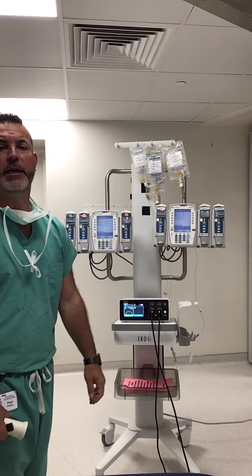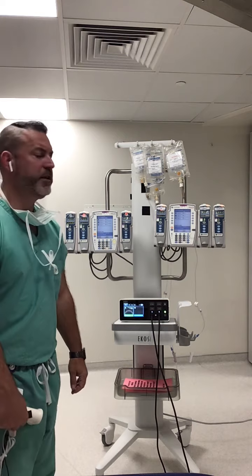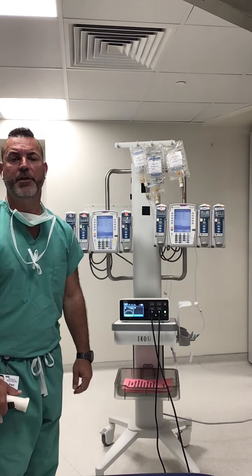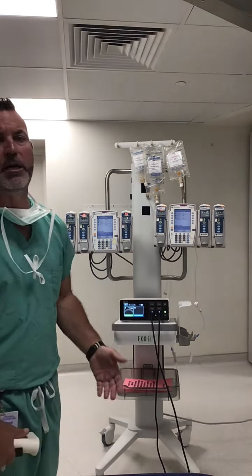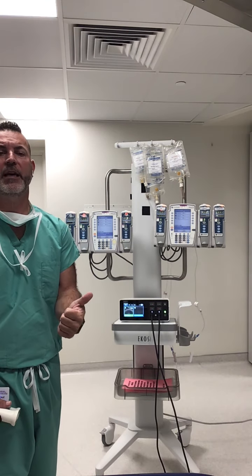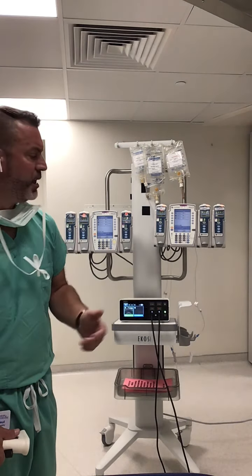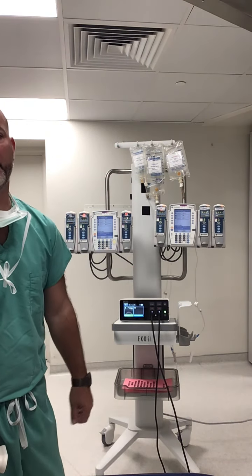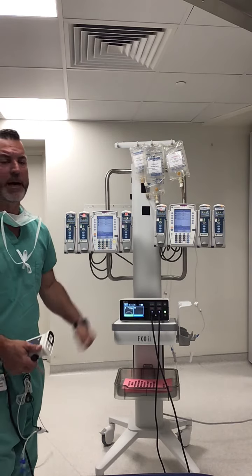I have no idea where anyone would be going for a transport longer than an hour. Most of your EMS and helicopters have inverters, so you can plug this right up, but just make sure that you plug your machines up no matter where you go. If you're transporting your patients from the cath lab, IRs or ORs, make sure that you take the extra step to plug in your unit once you get upstairs, just to help out your ICU friends or your recovery friends to make sure that we don't lose power.